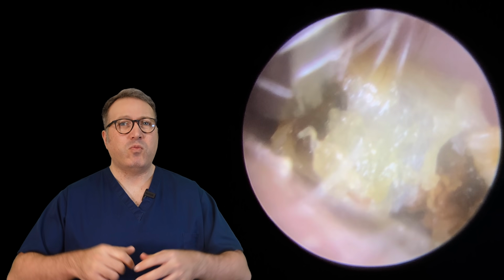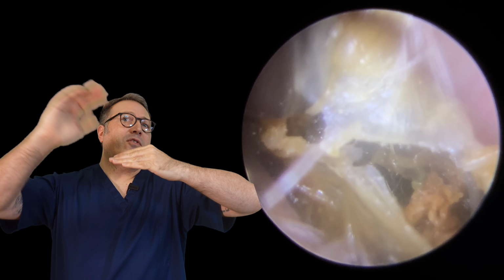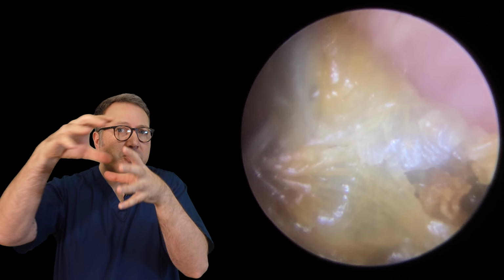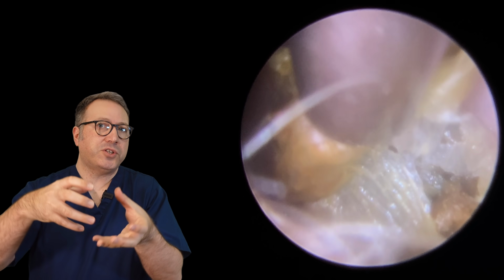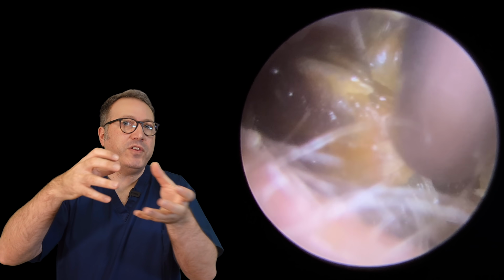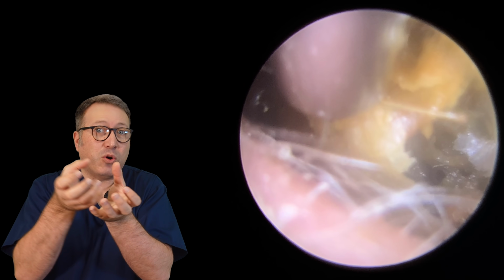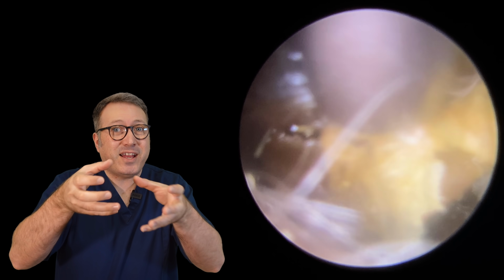What I'm going to do now, we've got this skin, you can see it really clearly here, this layer of skin underneath from the top and from the side as well, all collapsing in front of the suction. So if we can bunch and gather all this inside the end of the suction tube, it means I'm pulling on all sides at the same time, which is hopefully going to be enough pressure. We're using the strength of that skin now, as we said just a second ago, against itself. So we're holding on to this and really drawing this down the canal.